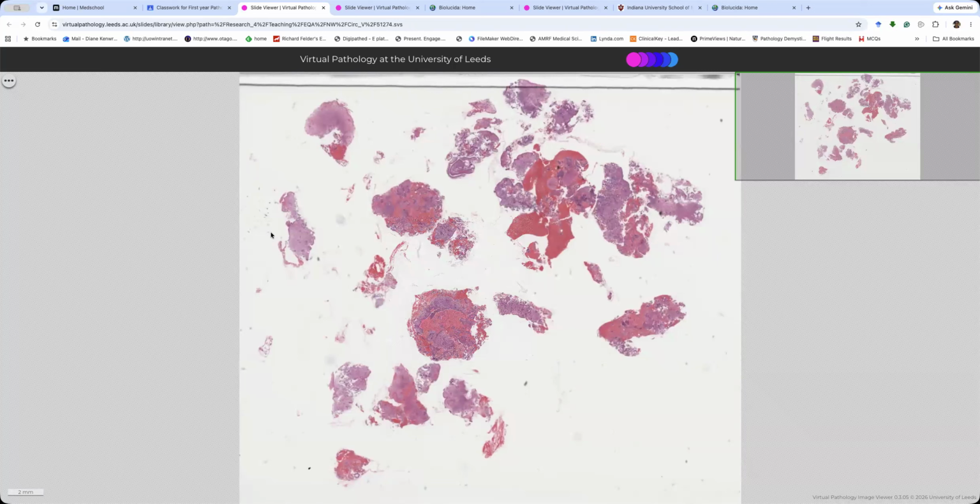It's pretty common where we've had an IUD in for a long time. Yeah. So with the modern Mirena replaced every 5 years, a couple of plasma cells is fine. When I was a young pathology registrar, we thought a couple of plasma cells were, oh, it's definitely chronic endometritis, but that criteria has changed a bit.